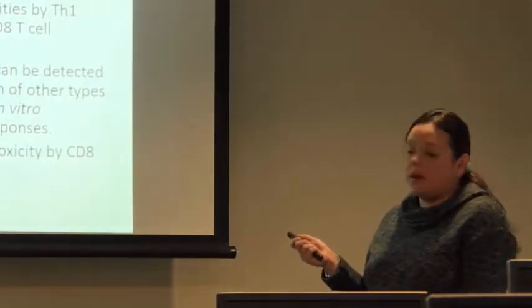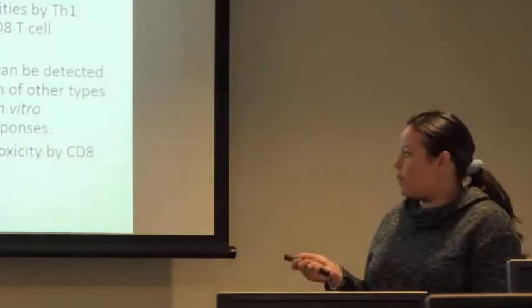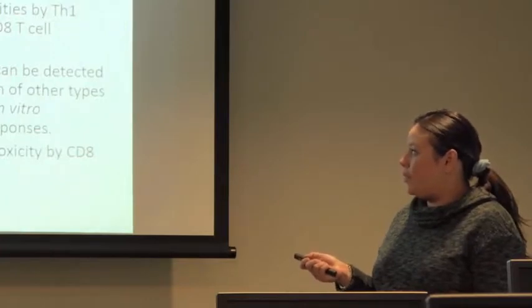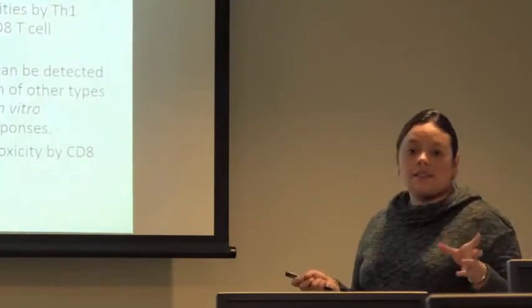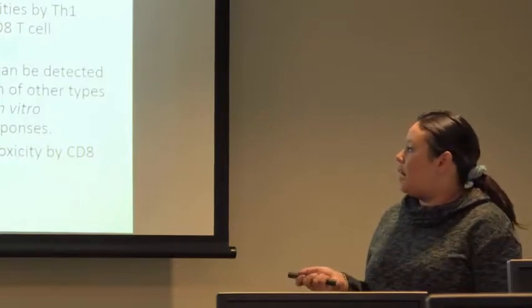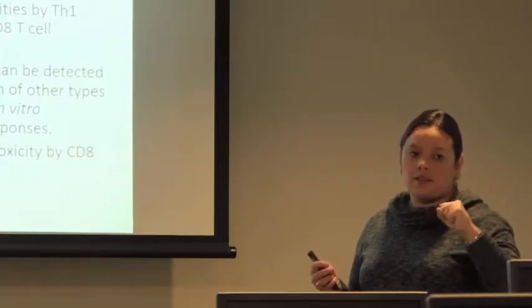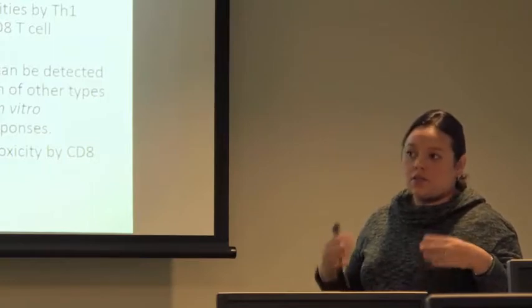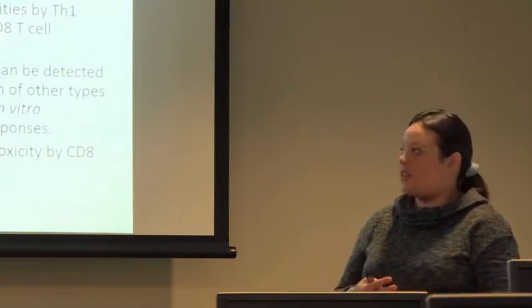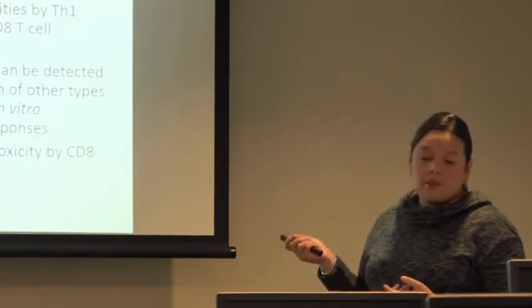Interferon gamma is produced in high quantities mainly by Th1 cells, and is frequently used to track CD8 T-cell responses, as I said before. While interferon gamma secreting antigen-specific T-cells can be detected directly from peripheral blood, sometimes these T-cells require in vitro expansion, or what we call in vitro stimulation, to augment the low-level responses, especially for the specific T cells that are in very low amounts in the peripheral blood. So you might have to do a two-step incubation with dendritic cells loaded with peptides of whatever specificity you want the T cells to be, and then test for interferon gamma responses against these peptides using the ELISPOT.